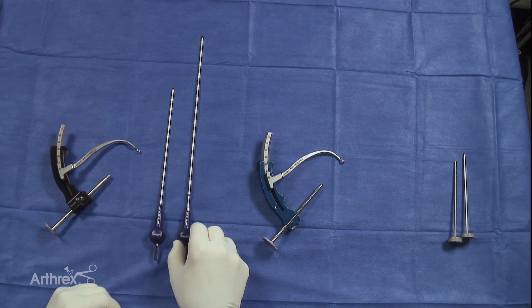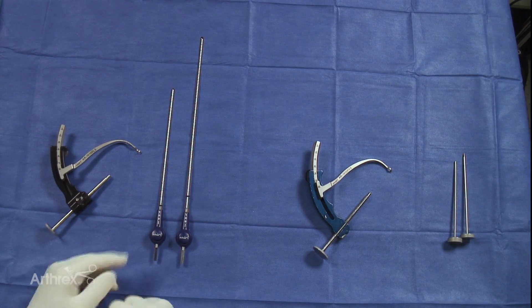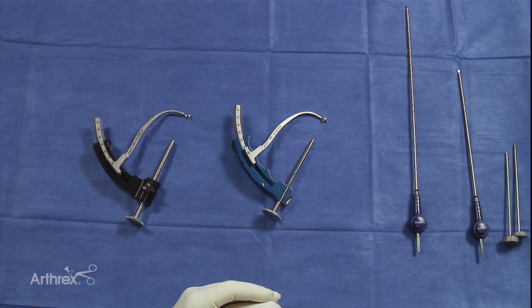Once again, this was the standard flip cutter that many of us have used over the last several years. You can see that the upgrade in the flip cutter is that it is shorter by three and a half inches. I'll demonstrate the differences between these two guides and these two flip cutter versions.